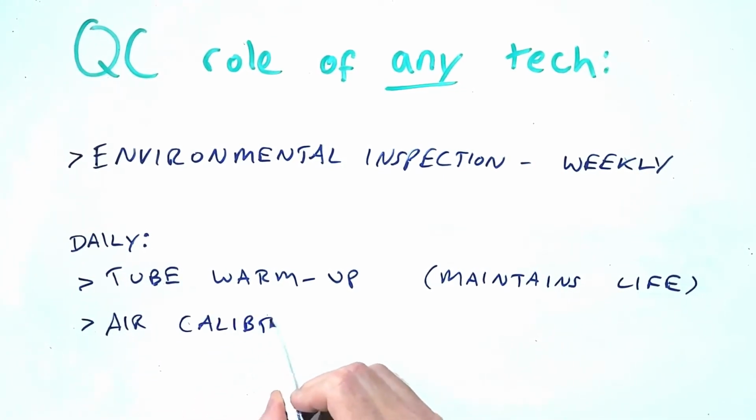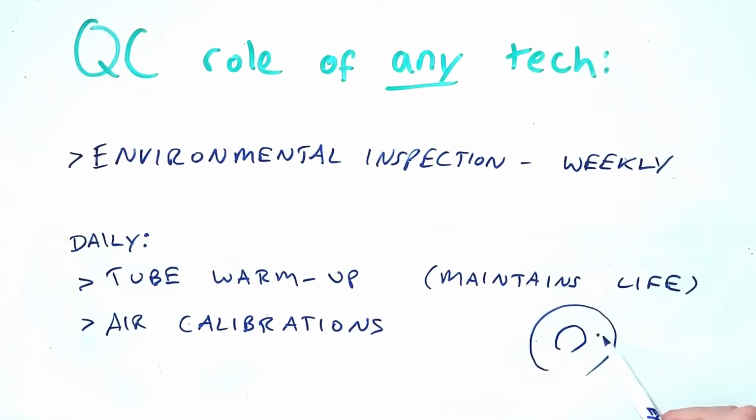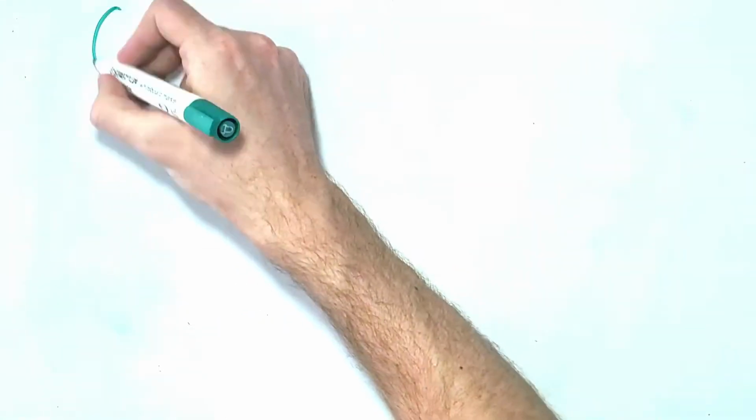Air calibrations are generally run by an automated scan with nothing but empty air inside the gantry. This usually takes about 10 minutes, and during this time the scanner will take several exposures at specified technical factors and assess how much radiation is reaching the detectors to calibrate its zero values and make sure that everything is working as it should.